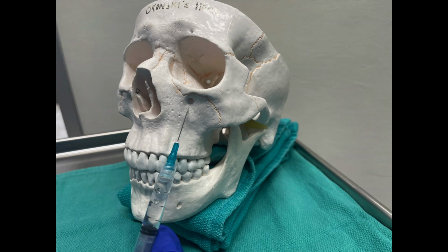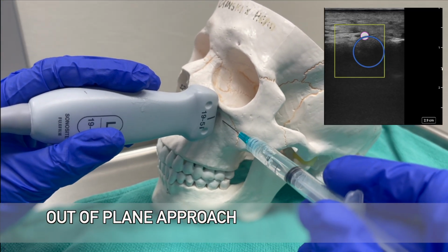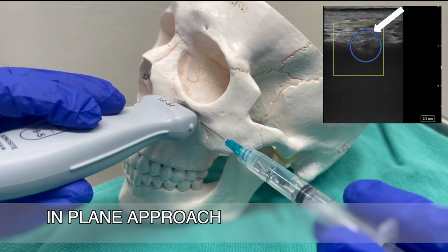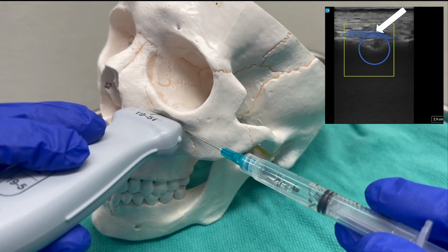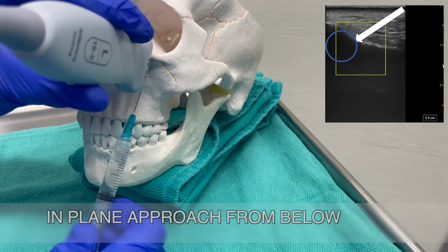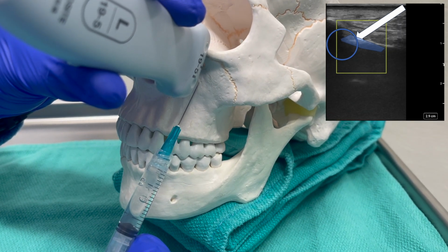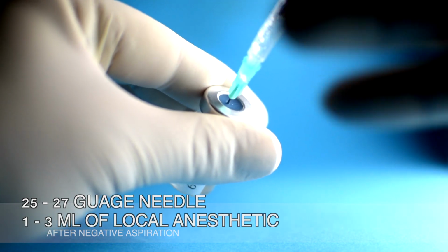There are several ways to block the nerve. The out-of-plane approach. Avoid vascular structures if possible with hydrodissection and careful needle control. The in-plane approach. Avoid injection into the foramen. The in-plane approach from below. Block with a smaller gauge needle and 1 to 3 milliliters of local anesthetic.